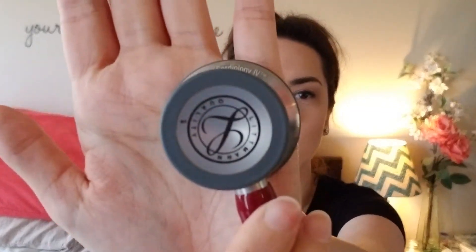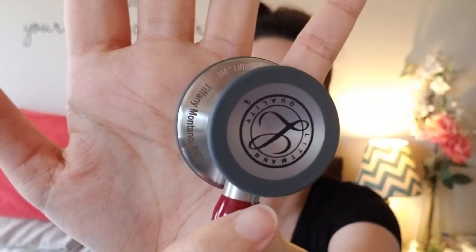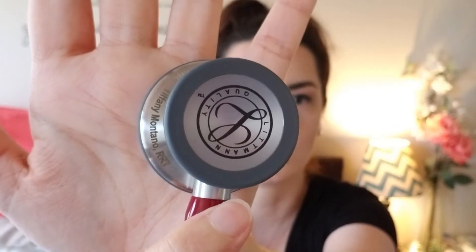The engraving was an additional $15 or so, and I believe it's worth it because I've heard a lot of people get their stethoscope stolen. This is an almost $200 stethoscope, so I really like that mine is engraved with my name and my title. There we go — you can see it there. It's really clear, and I think it was worth it to get the additional engraving.